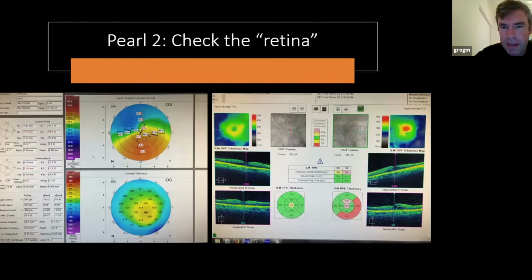There's a structure in the back of the eye called the retina, which we may not often pay that much attention to. But this patient was a referral from an optometrist to see whether we thought an IC8 would suit them, as we'd had some recent success with the IC8 in some other patients, and I was asked, would this patient be a good candidate? And I noticed in our clinic file that my colleague was treating the retina as well.